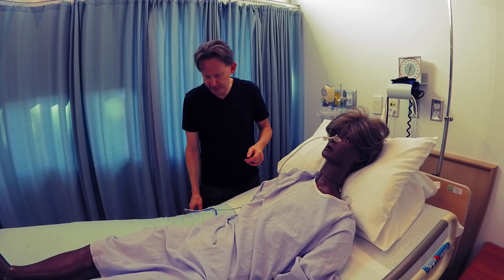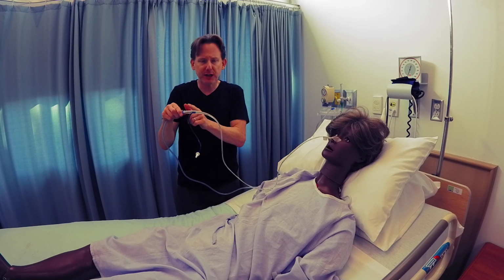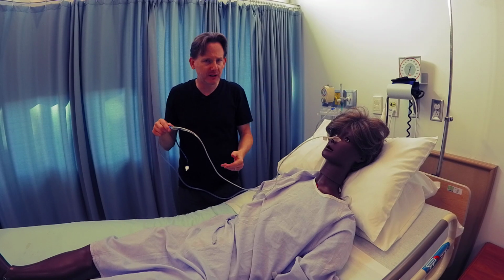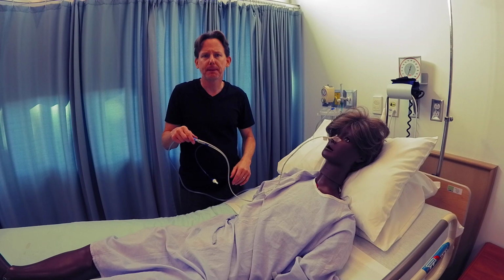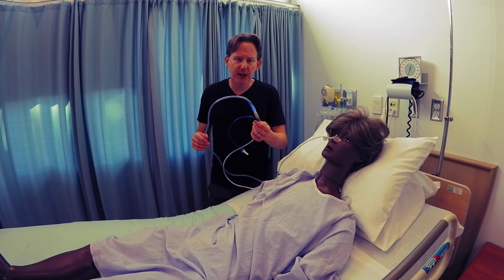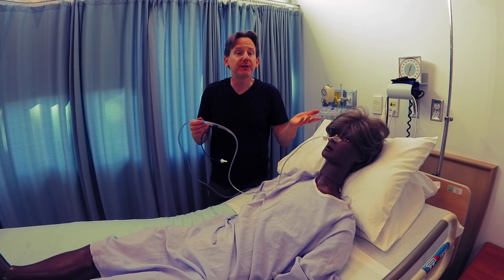In that case, and I'll just talk through this now, I'm not going to demonstrate it because that would be a different video, you would don gloves, turn the suction machine off, take this apart, and try flushing through some water, say 40 cc's, to see if you can clear out the clog or stop it from sitting against the stomach wall. Then you can reattach and see if you get suction. If that works, great. If not, another option is to get pancreolipase capsules ordered to get them down into the tube and wait the required 15 minutes or so to see if they break up what's blocking it.